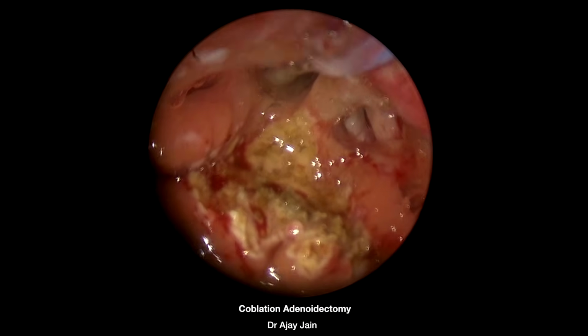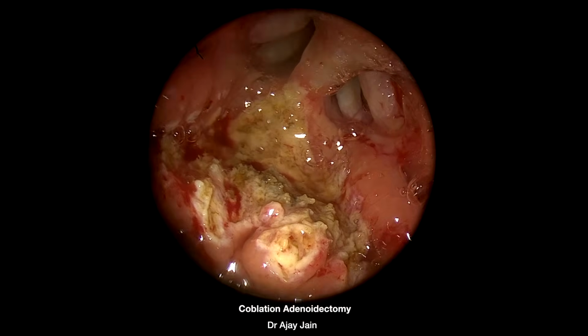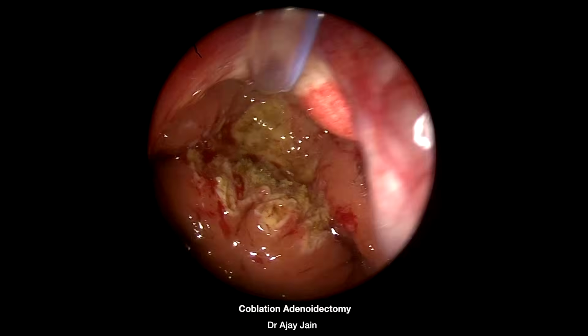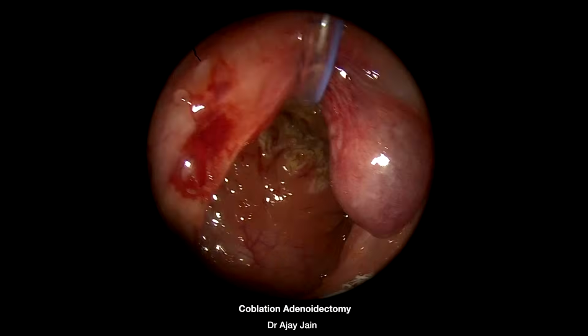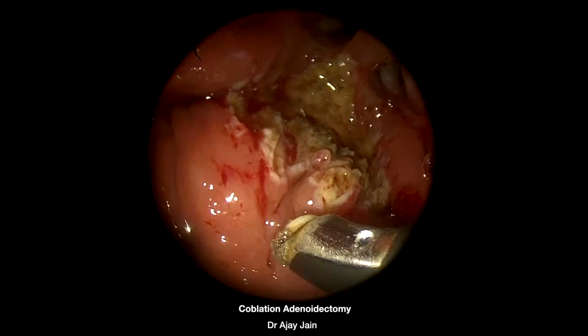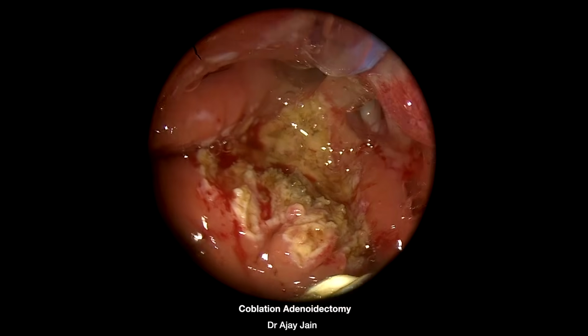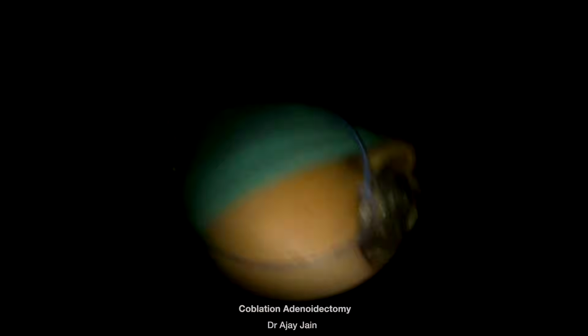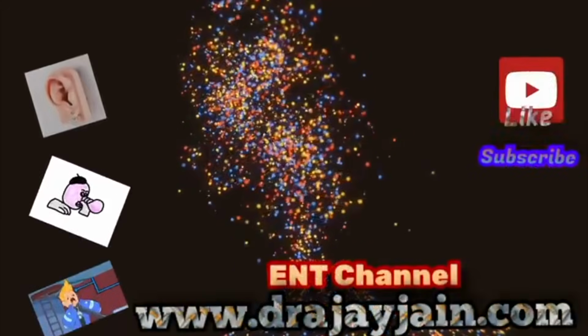Now I am seeing through the 70-degree nasal endoscope through the oral cavity. And I am just trying to see if I still need to do more, so I decided now to leave it.